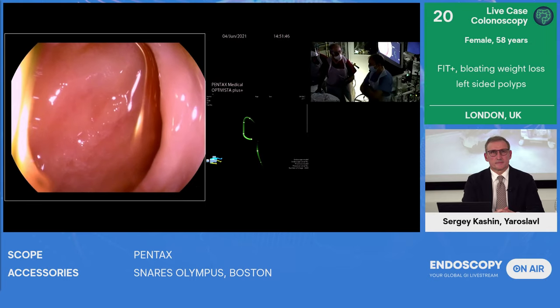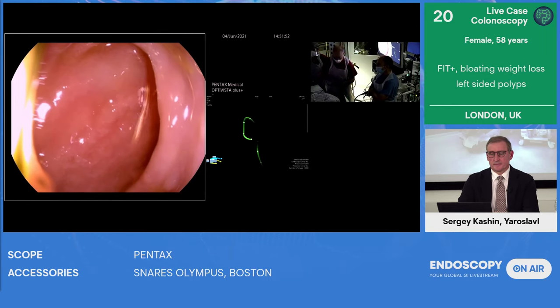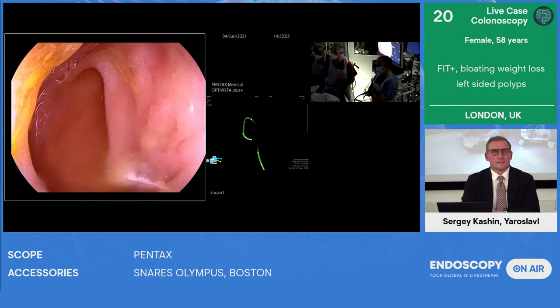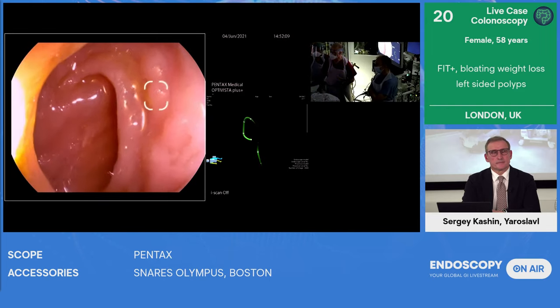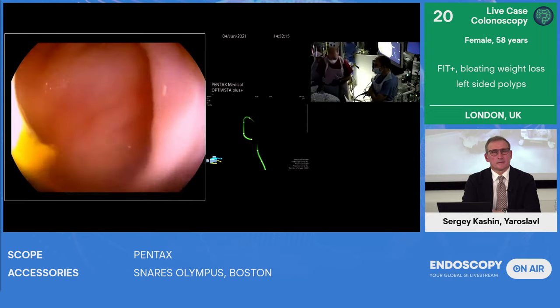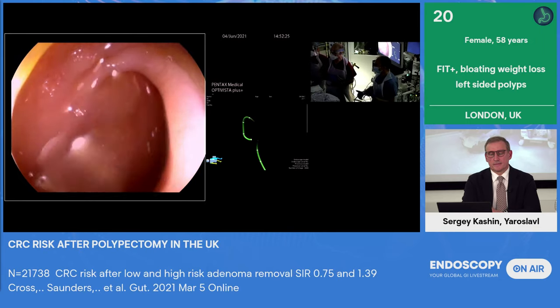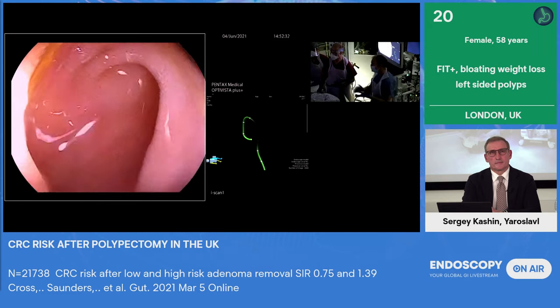Now, Ed, there's a big national trial of capsule colonoscopy in 10,000 patients going on. Do you want to just tell us a little bit about that? So the NHS have invested heavily in colon capsule for two reasons. Number one, you get additional lower GI investigation capacity. And secondly, we also have the ability to investigate patients at home. So we can send the capsule out in an Amazon parcel, and the patient can sit in their armchair in their front room and take the prep. And that's particularly useful if you have a patient who's been shielding, in the first part of the pandemic. So it offers a lot of flexibility. And I think so long as you're choosing to investigate lower risk patients, I think colon capsule is a good option.